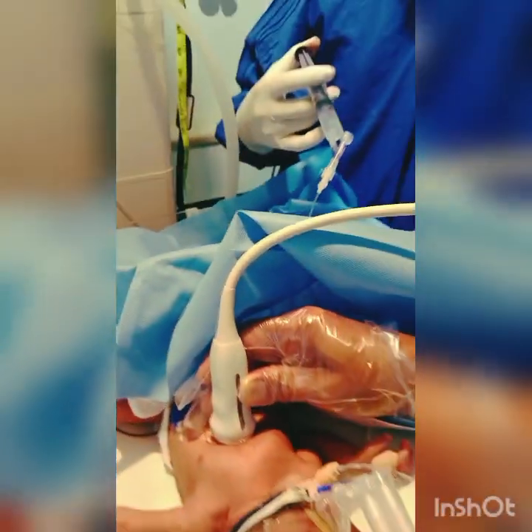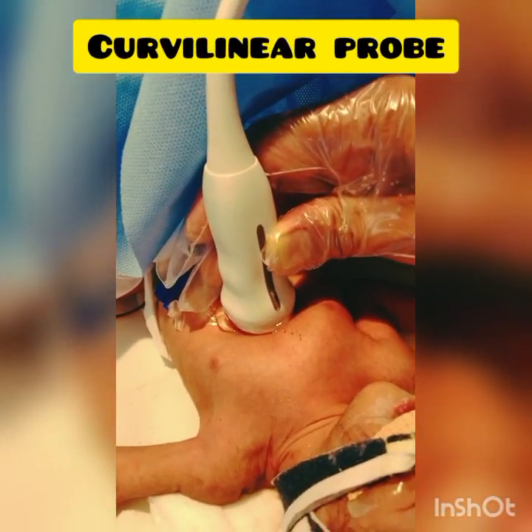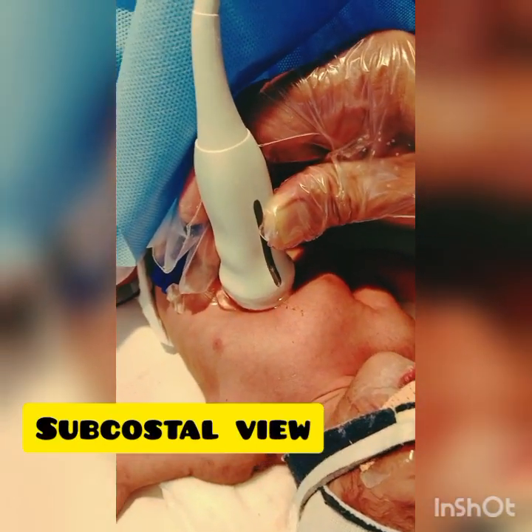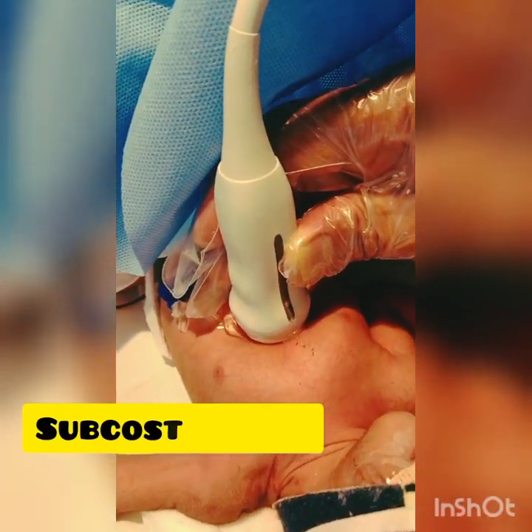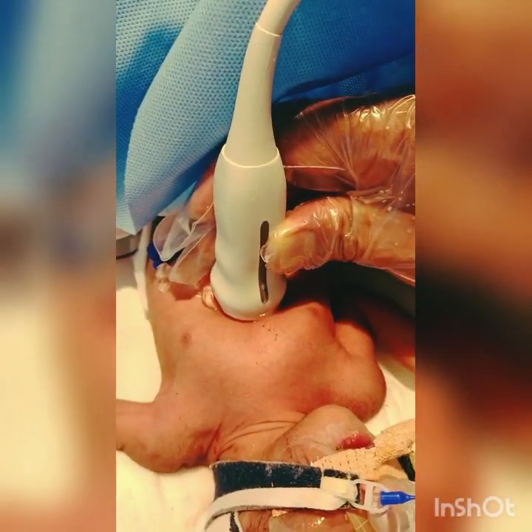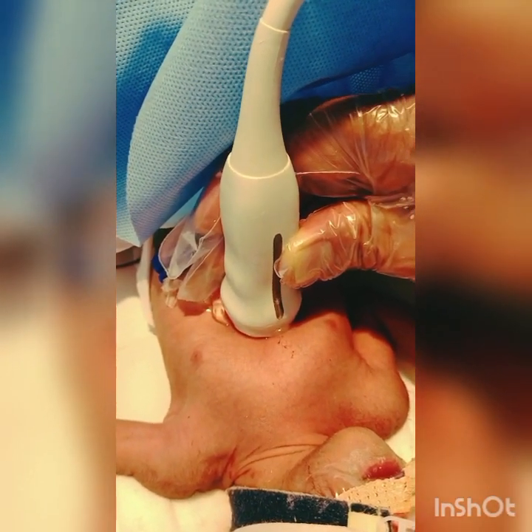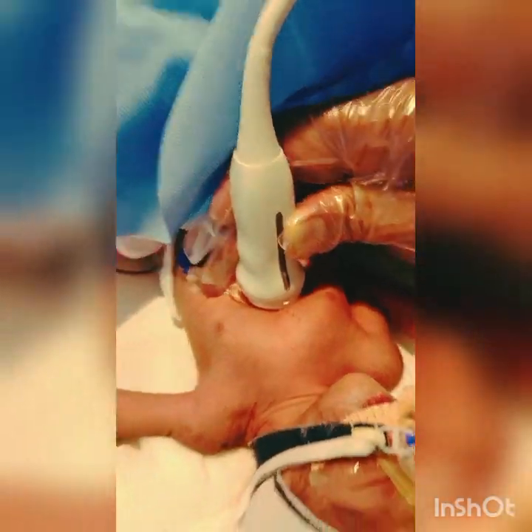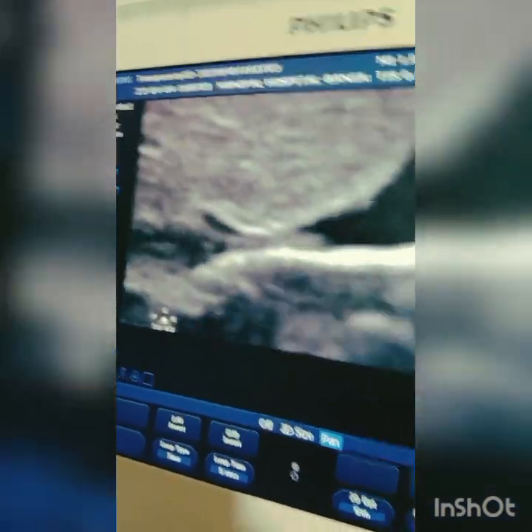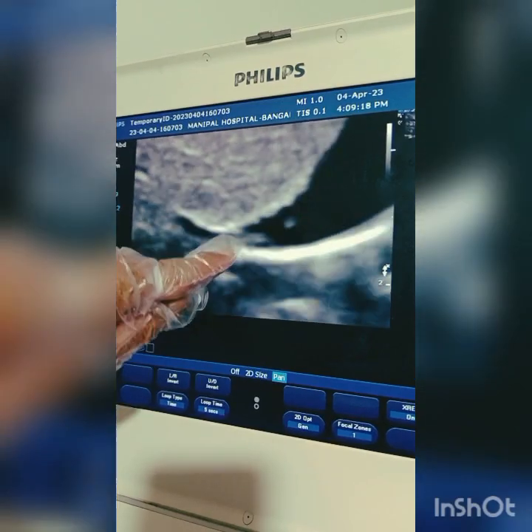While the PICC line is inserted, you should always confirm the tip of the PICC line using bedside ultrasound. The probe is kept — you can see the probe — this is the curvilinear probe kept in the sub-xiphoid area, with the marker facing up. This is the subcostal sagittal view where you can see the right atrium.